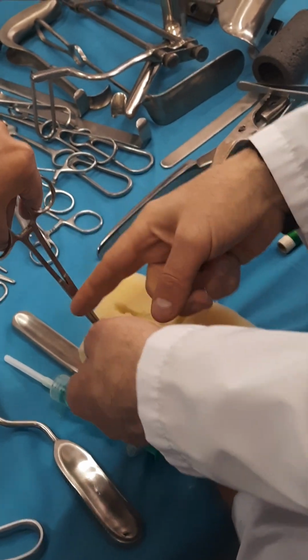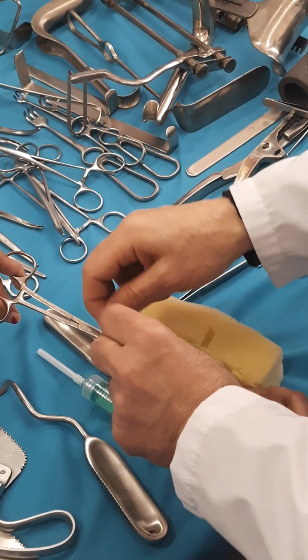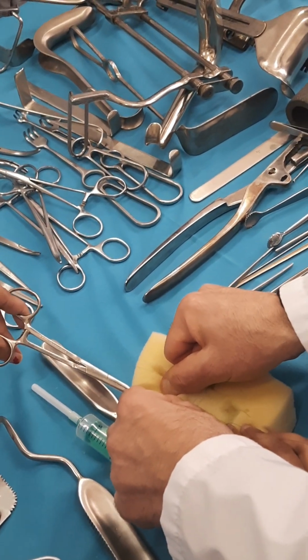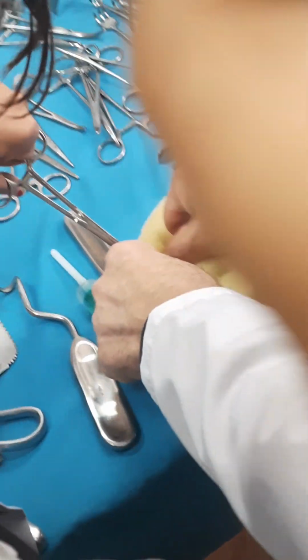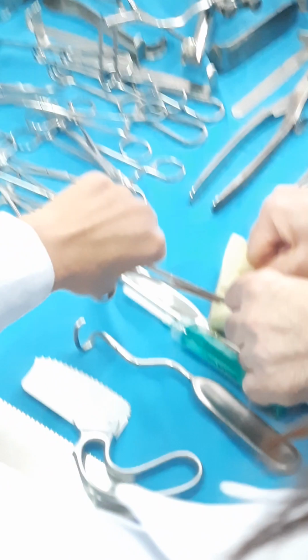Now what I'm doing, again I say show me the tip of your instrument. Very well. Now this is a normal thread, it will not be disconnected, as I will show you normally. Now you must open your instrument and remove it. Awful. Awful. It's good that you don't do something like this. This thumb and the fourth finger. Now how long will I wait?